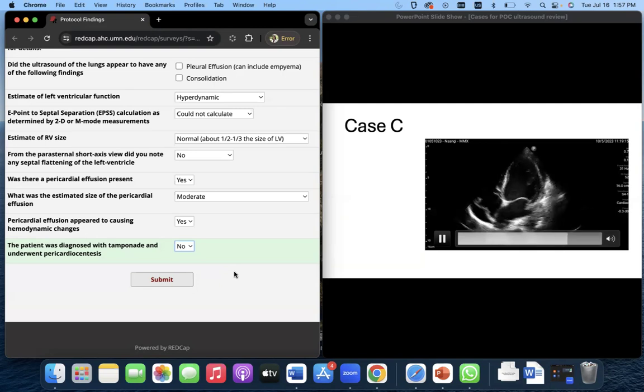We do know the cryptococcal antigen was negative and the HIV test was negative, but could it be tuberculous? Could it be viral? Could it be hemorrhagic? Whatever the history might be, it will help you figure out what could be causing the pericardial effusion. But for what we do about the low blood pressures and this finding of early changes of hemodynamic compromise, ultrasound helps you feel very good about giving more fluids.